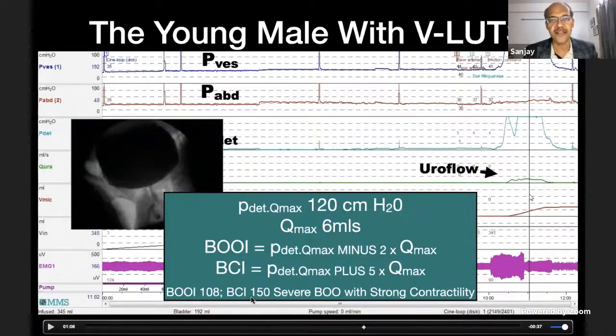So this is unsatisfactory. We are currently in the process of a Delphi study with 3 other international investigators to actually look at this to see whether we should be having sub-classifications of the contractility index. We'll next go to neurogenic lower tract dysfunction.